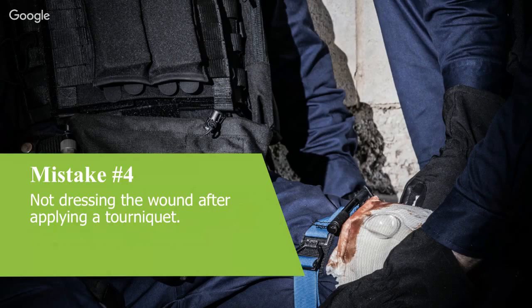The other thing that you need to consider is if there's been a traumatic amputation and a bone has been severed, particularly the long bones, the thighs, the humerus, you will continue to leak blood through the bone marrow. Now, most of the audience are aware that the bone marrow has an excellent blood supply, and the reason we know that is we can use intraosseous to drill into it and use it just like you would a large bore drip. So think of it in that context. The bone marrow is getting a lot of blood through it. If you've had a blast injury, for example, or a motorbike accident, and the limb comes off and the bone is severed, it's going to continue to bleed significantly through that marrow.